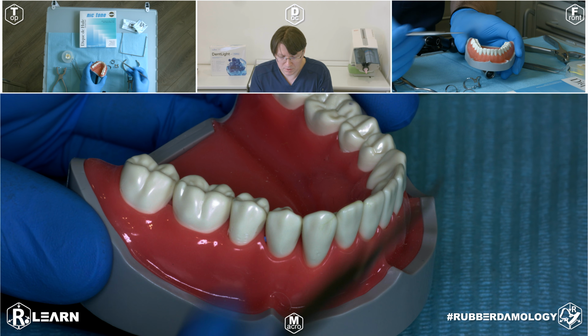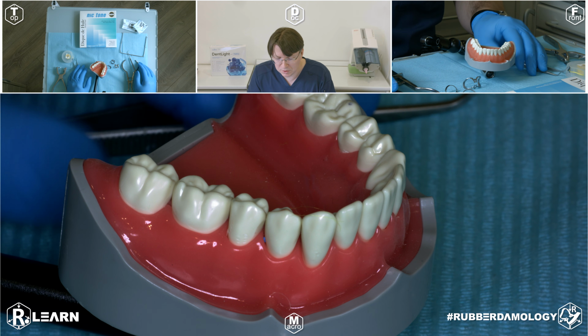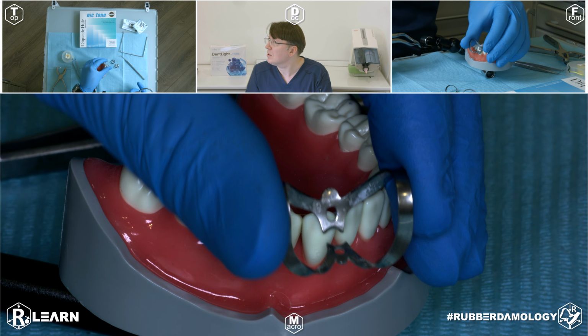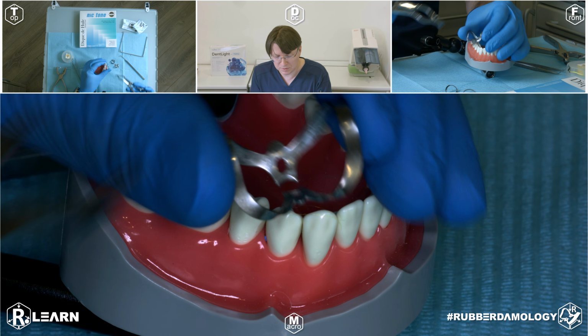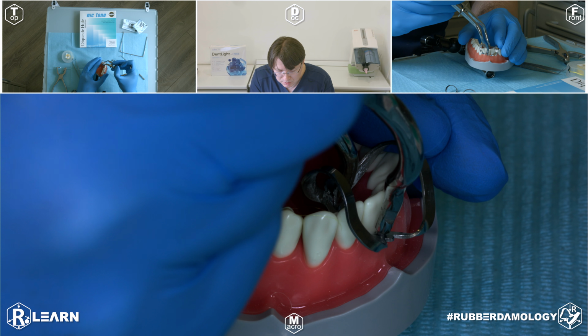First of all, incisors. Two types of clamps you can use for this group of teeth. Clamp for incisors, butterflies, number 9 or W9.